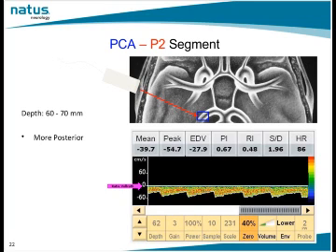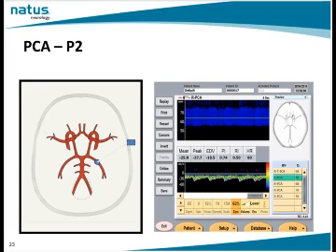Let's show you this on the M mode, and again, it'll help you to verify where you are. In M mode, the P2 portion now is going to show up in blue instead of red when we're in P1.